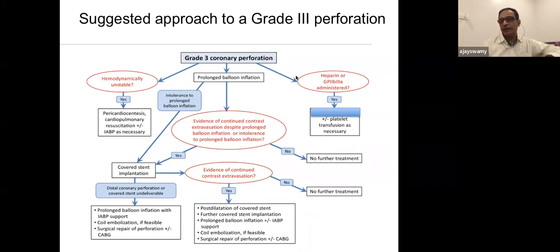The reversal of heparin is an oft discussed issue. There are multiple views on this. However, if you have hardware inside the coronary, it is not at all safe to reverse the heparin. It's all right to reverse the heparin once you have taken everything out. If the vessel is already gone and you're willing to sacrifice it, that is a totally different issue. I mean, you have a small distal RCA perforation and you're not able to close it. You want to reverse the heparin, you think that's going to work, you can go ahead and do it.